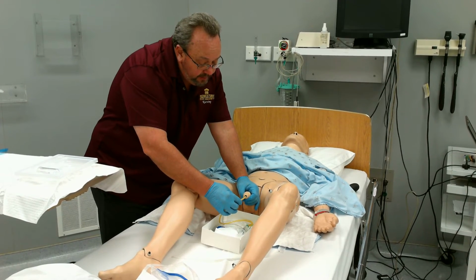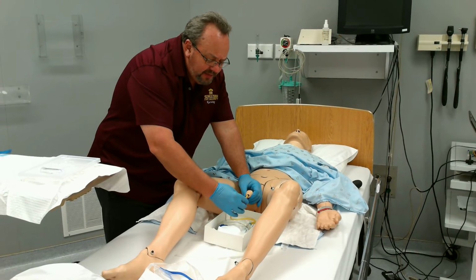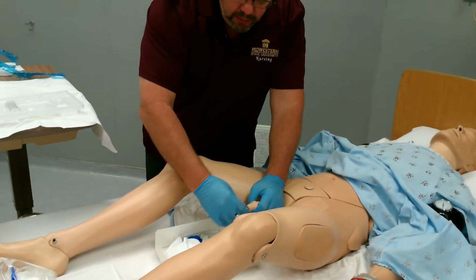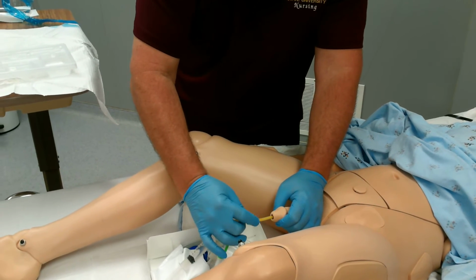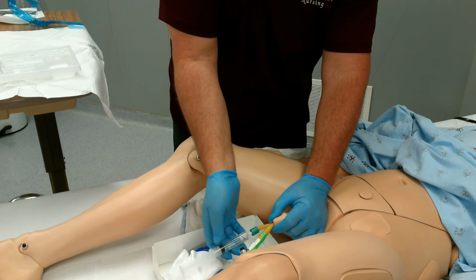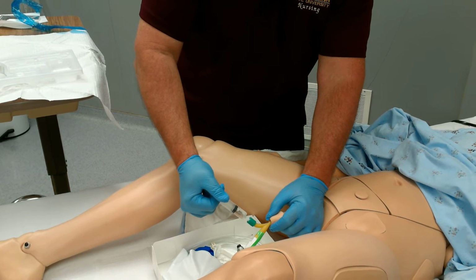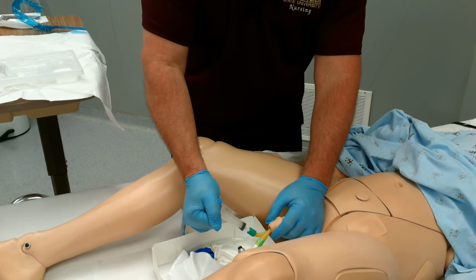Then I will take my lubricated tip and I will say, okay, you take some deep breaths now, and I will insert. And I will just keep inserting, making sure I don't touch my sterile hand to the end of the penis. Insert it all the way. For a male, you will go all the way to the Y, or the bifurcation of the tube, to there. Then I take my normal saline, my sterile water, and I fill up that balloon that's at the end of the catheter.